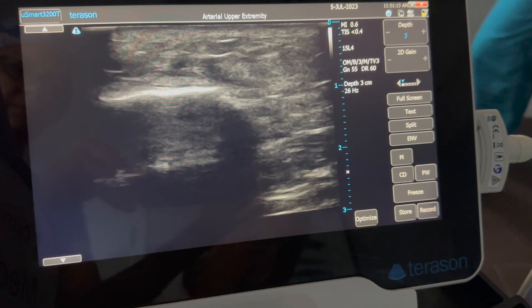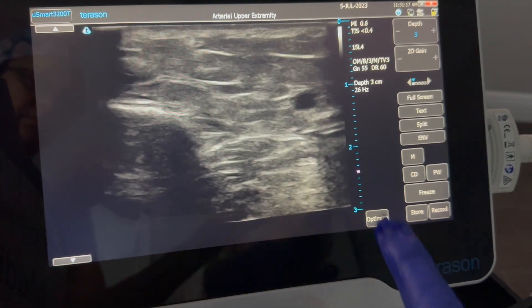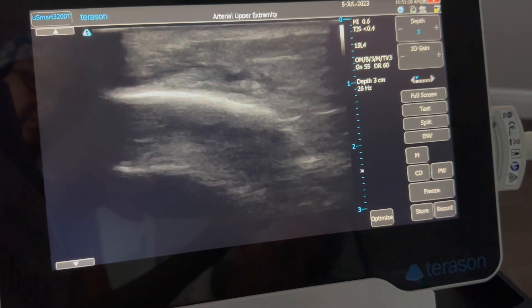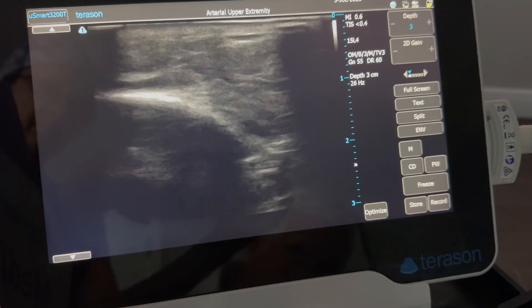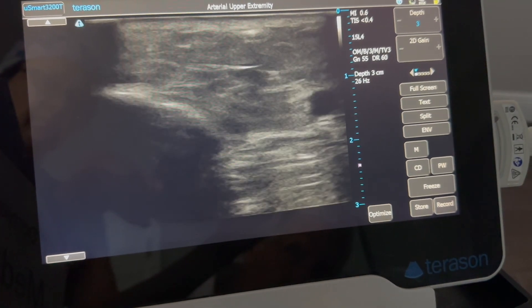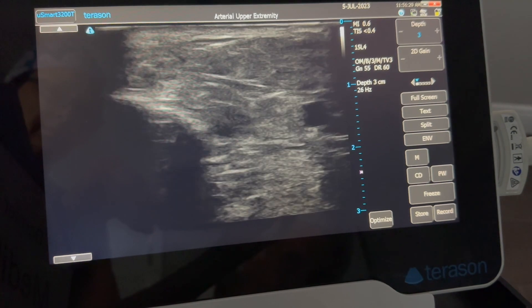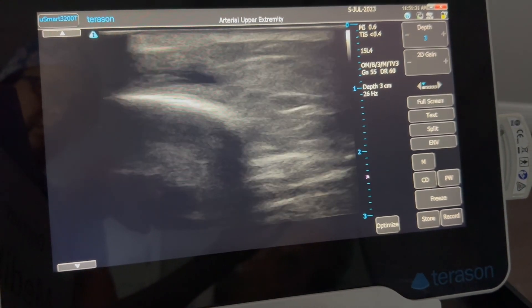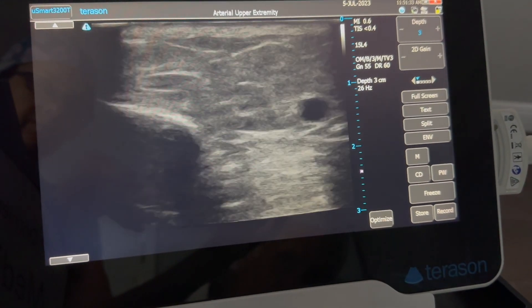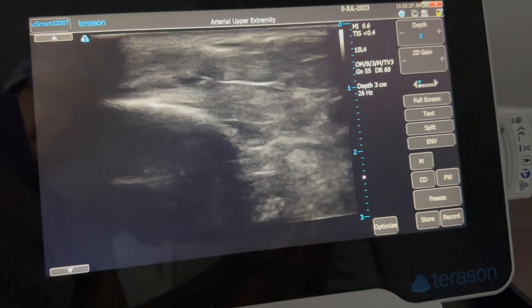Now we're right over the complex. You can see there's foam. Here's the saphenous down here. There's actually foam in some of the small vessels here — that's out of this area of stasis. This is kind of proof positive that this was the etiology of all this. The staining is actually secondary to the leaking of red cells from this hypertension.